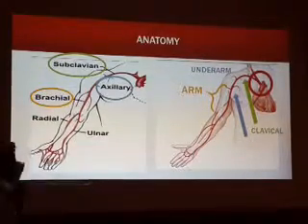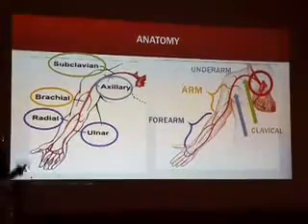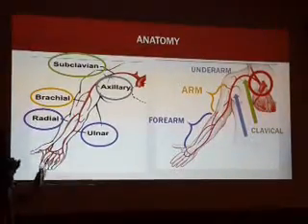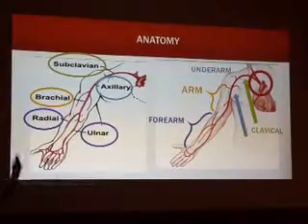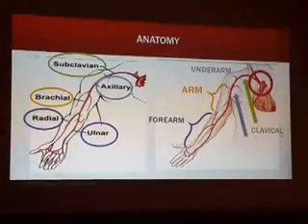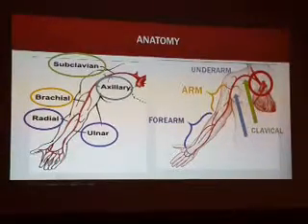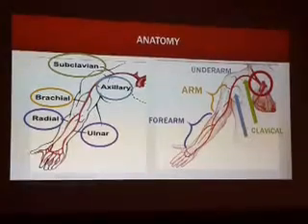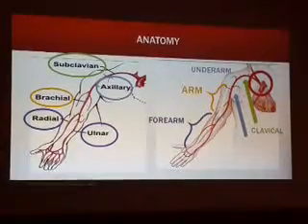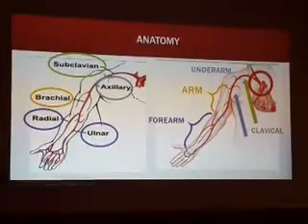An arm has one artery, which is the brachial artery, and then the brachial artery bifurcates in the forearm into radial and ulnar. This is the interesting artery, the major artery that supplies the upper extremity. You have to evaluate each one of them at each segment. So when I examine the radial or brachial, I will divide it into proximal, mid, and distal. I will not take one segment and say this is the brachial artery. No, this is random scanning. You should be specific. Take upper, mid, lower, each segment. You are showing the radiologist it is normal, and it includes all the pathology that is needed.